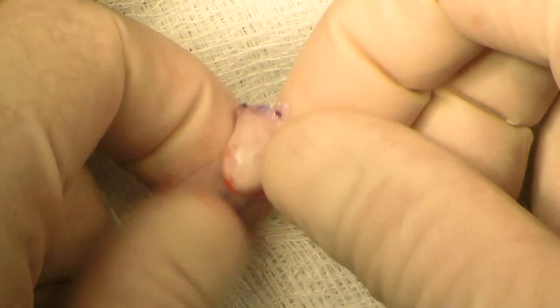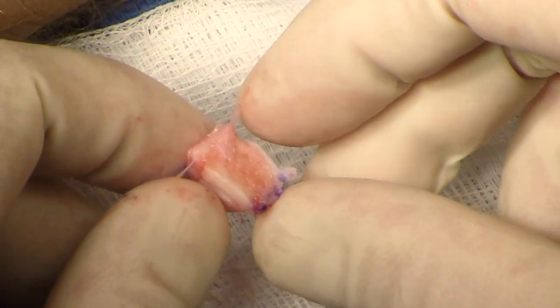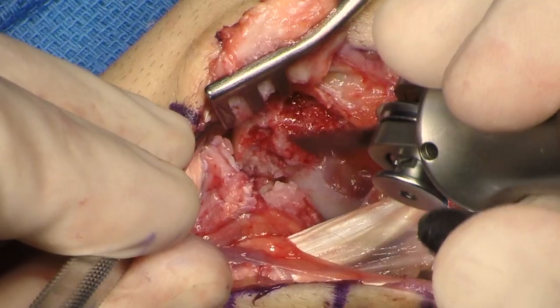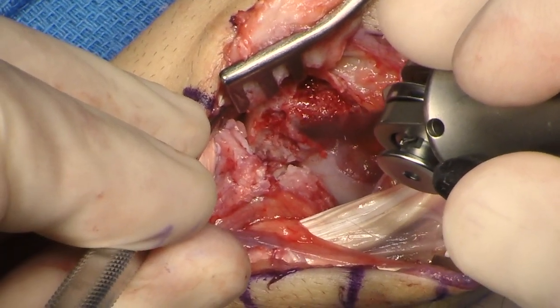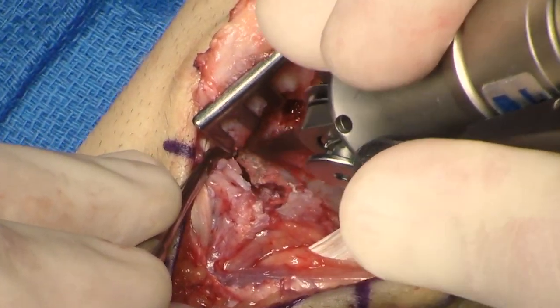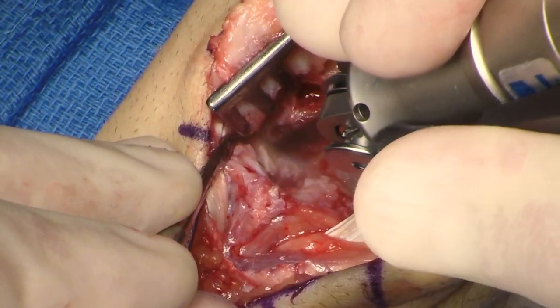The graft is inspected. It will be rotated 180 degrees, and the scapholunate ligament will be sewn to the volar capsular attachments. The scaphoid is then trimmed using a sagittal saw in order to get a flat surface for appropriate apposition of the graft.